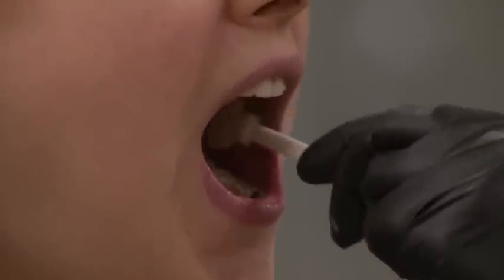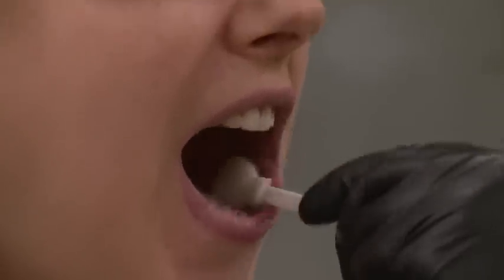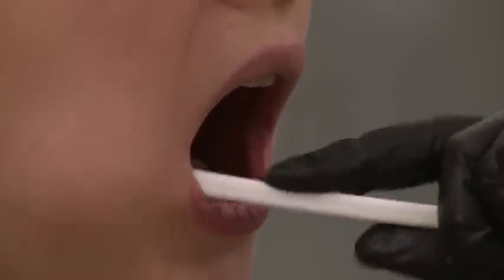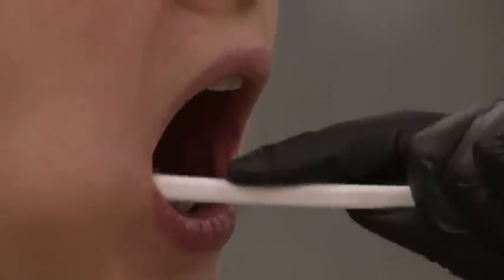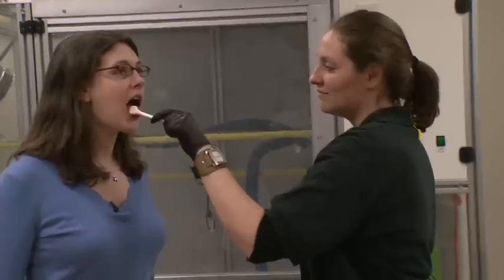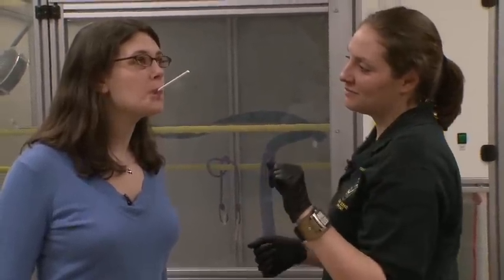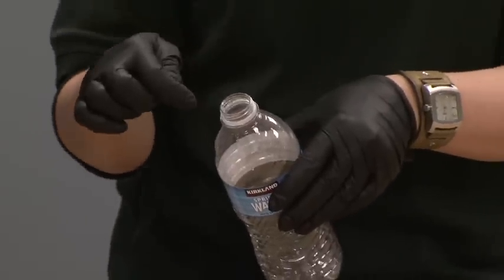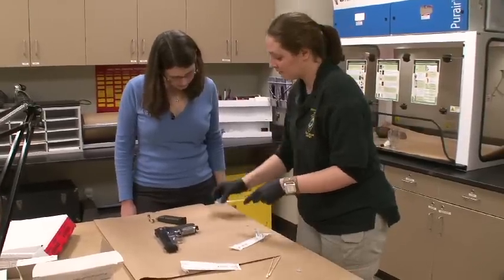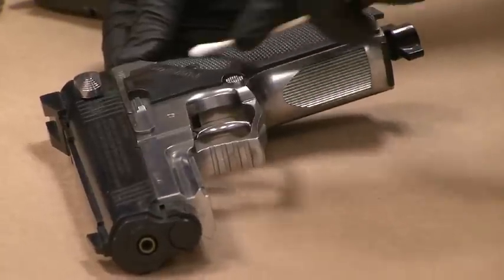During the filming of this lesson, I had the opportunity to visit the identification unit at the Cambridge Police Department. This is the lab where the Cambridge Police Department can investigate items found at a crime scene for things like fingerprints or for DNA. So for instance, here you can see that I'm getting my cheek swabbed. This is how the technicians at the identification unit isolate DNA from someone who's potentially a suspect. They can also isolate DNA from items found at a crime scene, such as a water bottle or a weapon. You can watch a full video tour of the identification unit in the video that's found after this lesson.